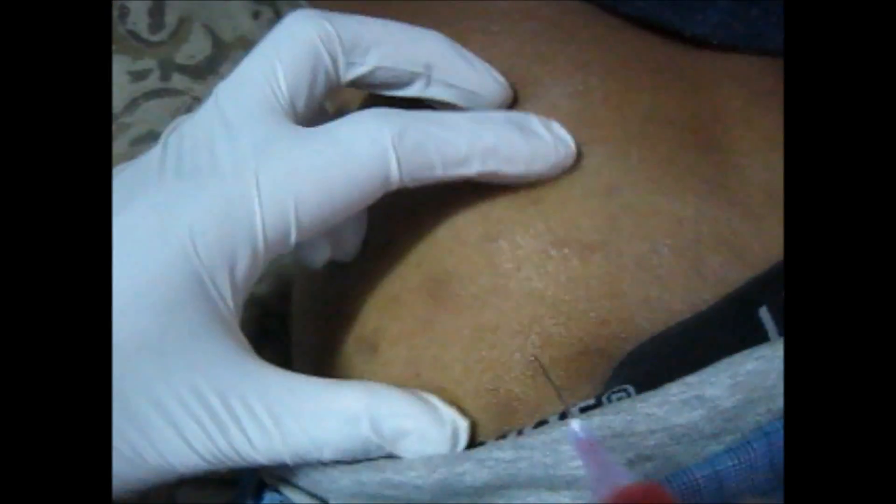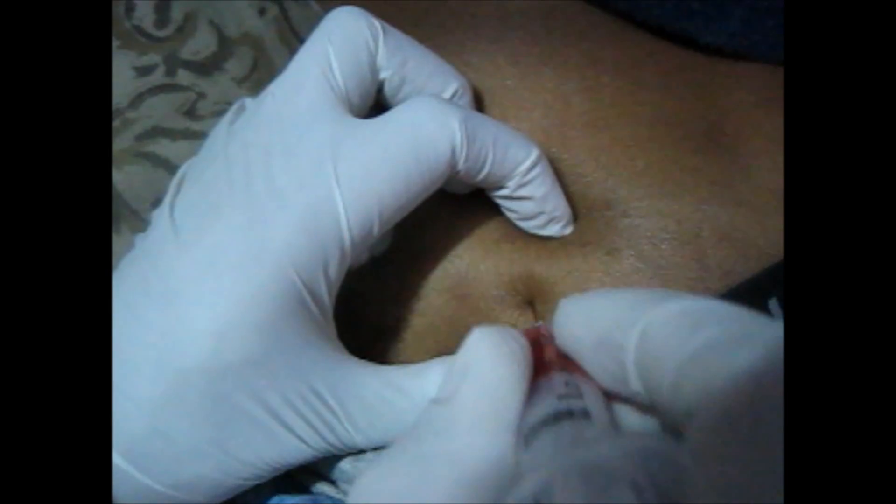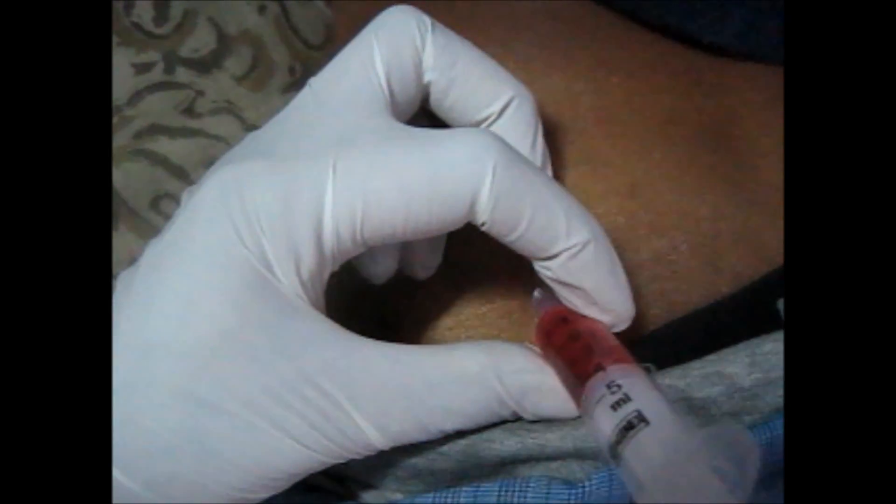The simplest way is to put your fingers at the anterior superior iliac spine and put your thumb like this. The point where your thumb reaches is actually the site where you can give the intramuscular injection. Then you need to stretch it a little bit and hold like this.